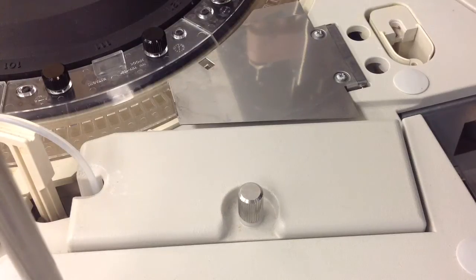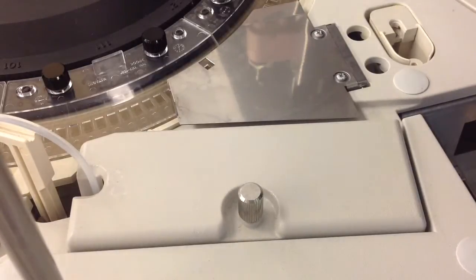Today I'm going to be showing you how to replace the ISE measuring cartridges. This is a maintenance function that Roche recommends to do every two months and is under the miscellaneous maintenance section in your utilities area.